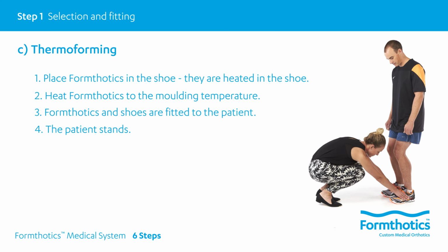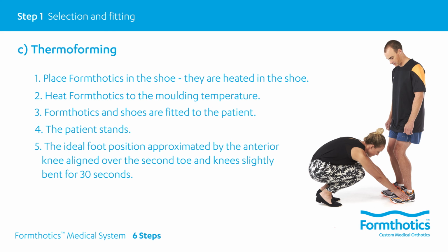Formthotics are thermoformed, heat molded to the foot within the shoe. The ideal foot position is approximated by having the anterior knee aligned over the second toe and knees slightly bent so that the body's weight is evenly distributed across the surface of Formthotics. The clinician forms the Formthotics up into the arch and heel area with both hands. The patient holds this position for approximately 30 seconds, completing the thermoforming process.